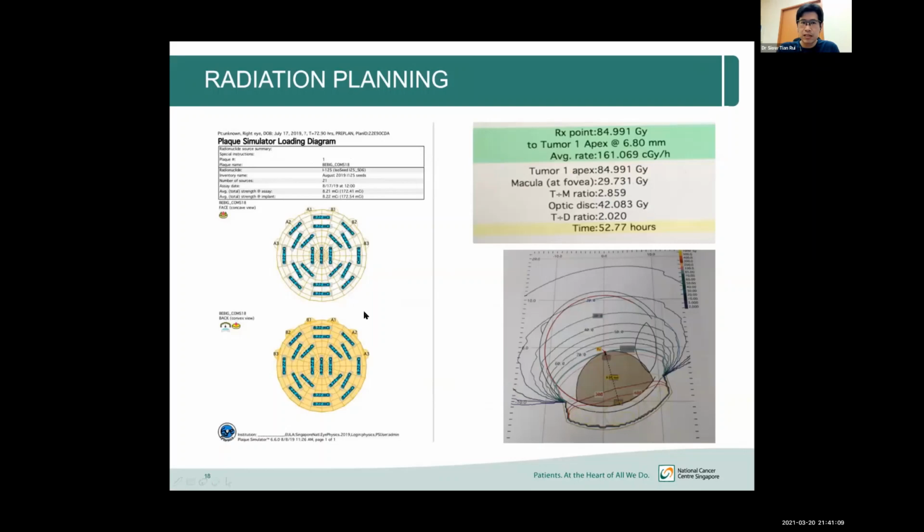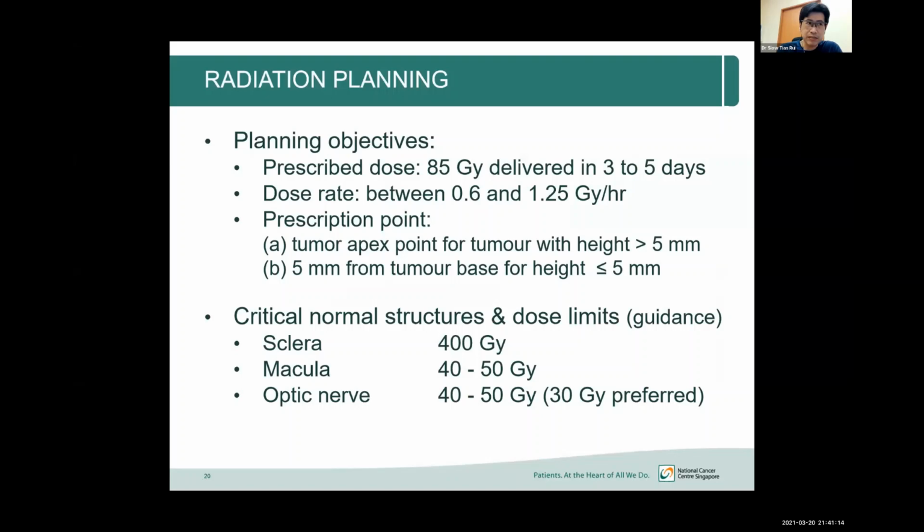Now, I'll come to that later. So what are the planning objectives? A lot of these planning objectives are taken from the ABS guidelines. And this is the part where I said we've had to adapt some of these numbers, or else our program would never have been able to take off.